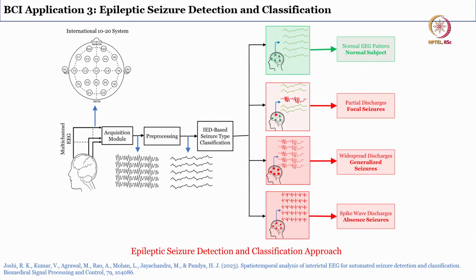So you see that again it's a very big figure but very easy to understand. Let me help you. EEG is acquired from the scalp, not invasively, a non-invasive way. You all know what this is. Okay, the 10-20 system is used to place the different number of electrodes. Then this is like an illustration of how it will help you get an idea. But if you observe it properly, it conveys a lot of information.